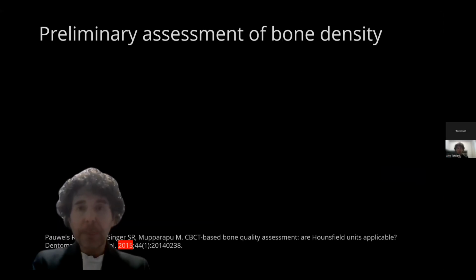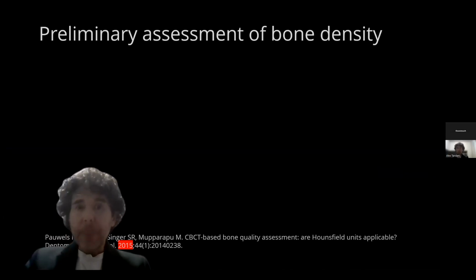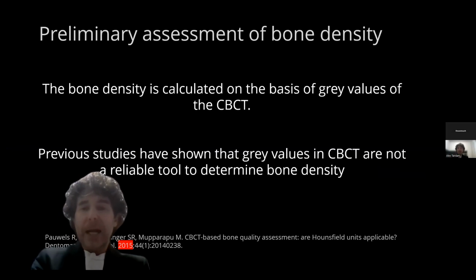So, let me touch on a bit more theory. When using the magnetic mallet, it starts from a fundamental concept. We want to change typically bone quality or preserve bone without removing it. So, the key thing to assess on our CBCT is the bone density itself.